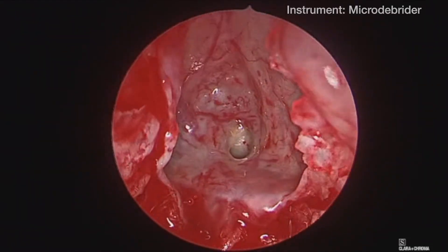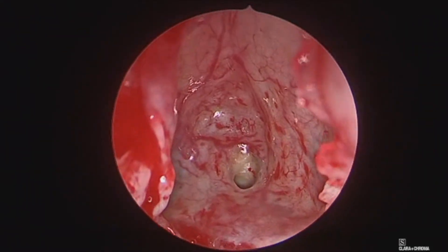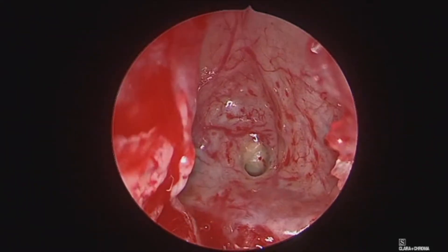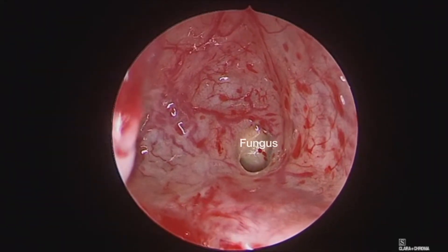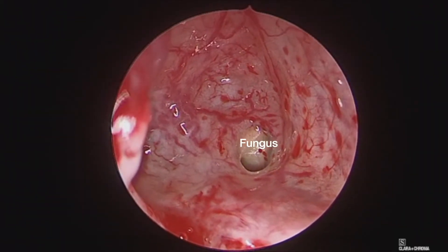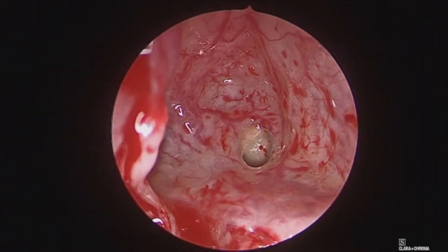Following this, several septations are removed and you can begin to see the fungal elements in the outflow tract.